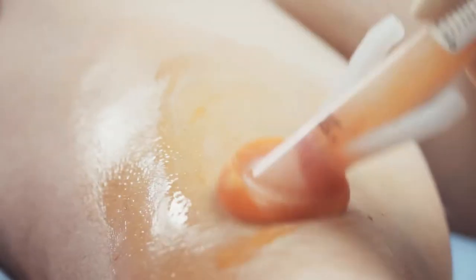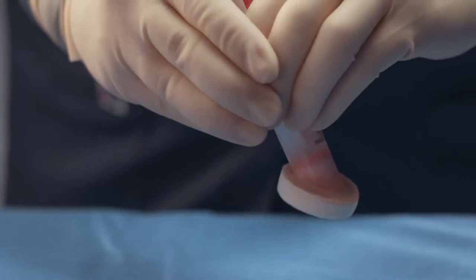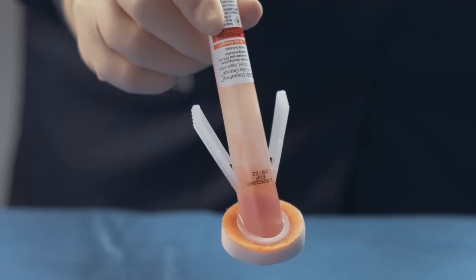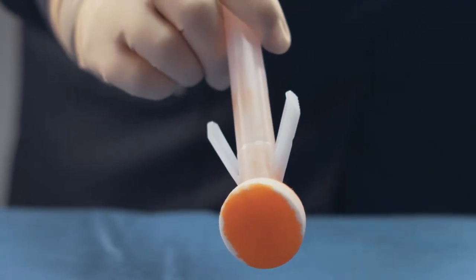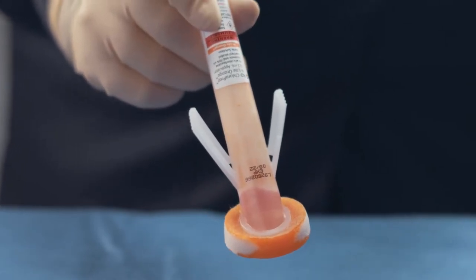The BD Chloroprep Patient Preoperative Skin Preparation with Sterile Solution 10.5 Milliliter Applicator is easy to use. Simply pinch, apply, and allow to dry. The applicator's patented wing design allows for easy activation while promoting aseptic technique by keeping hands away from the patient's skin.